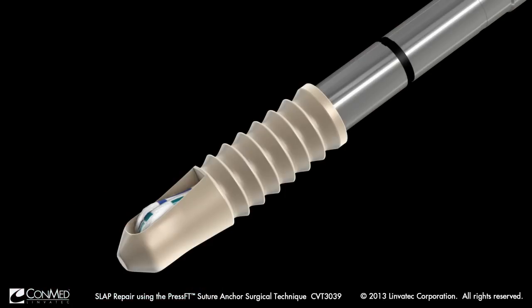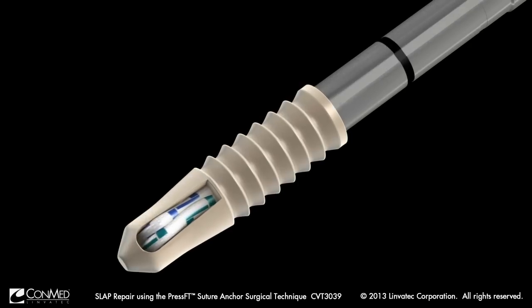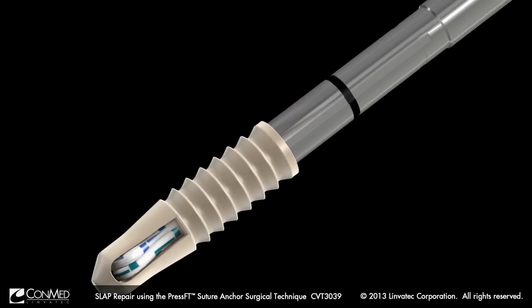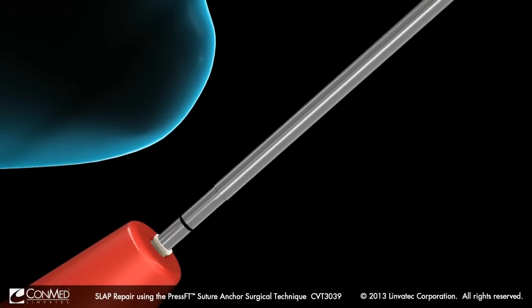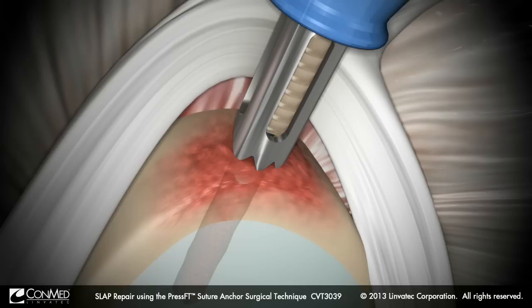Prior to insertion, align the vertical suture eyelet of the PressFT to face toward the biceps tendon and superior labrum. Pass the PressFT implant through the drill guide and into the pilot hole. Use a mallet to advance the implant until the distal depth mark on the driver is below the surface of the bone.